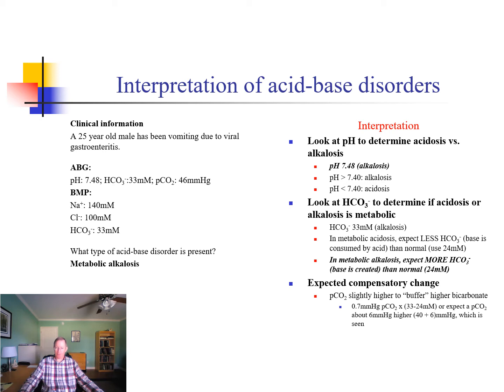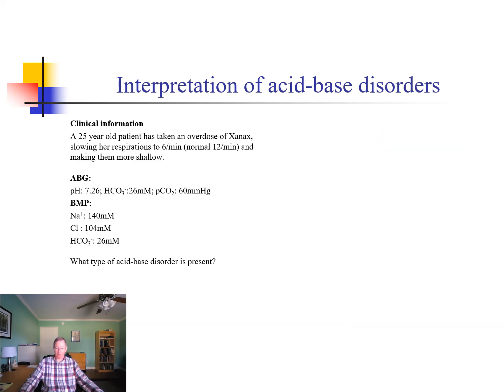So wonderful. Let's try another one. We could also say, hey, the guy was vomiting, he was vomiting hydrochloric acid, and therefore I would expect a metabolic alkalosis. So let's go to this one.